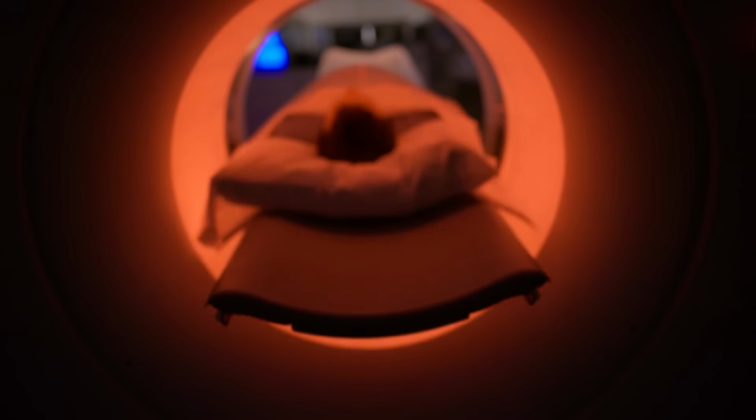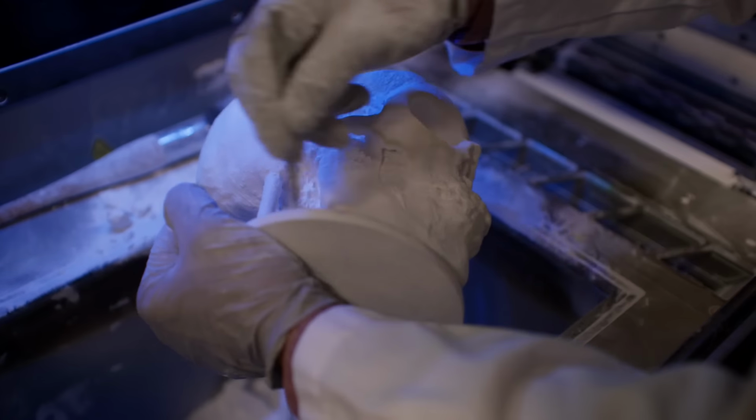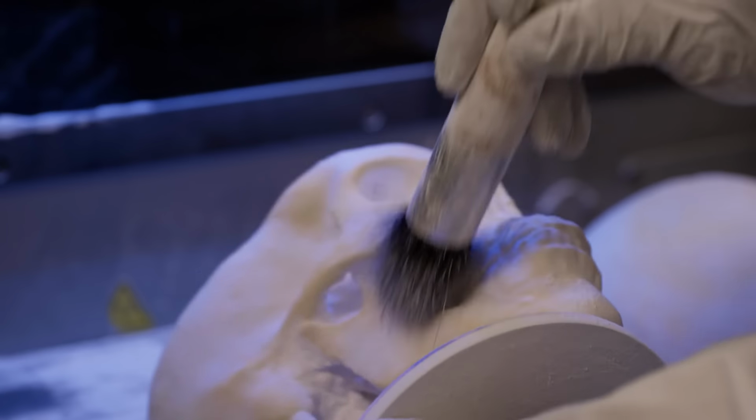The next step beyond the segmentation, beyond making the 3D models faster, are those predictive algorithms. Let's say someone had an eye socket fracture on both sides, a case where everything is broken. The AI can actually tell you, this is what this should look like. This is the best anatomic alignment of the fracture you're dealing with. Then this can be 3D printed. This is going to be really revolutionary for complex facial reconstruction.